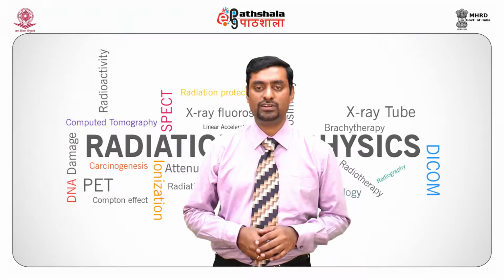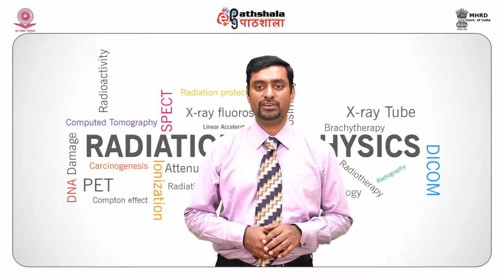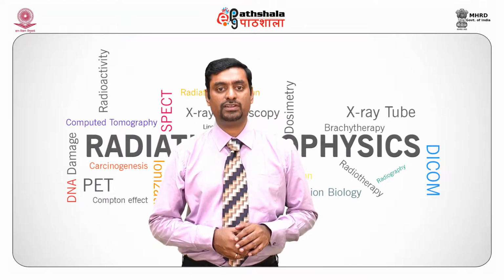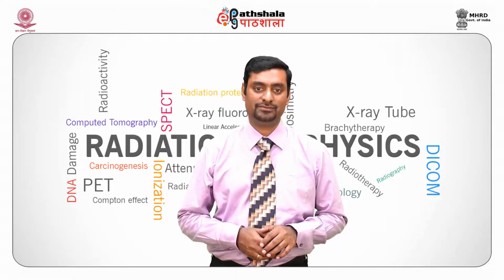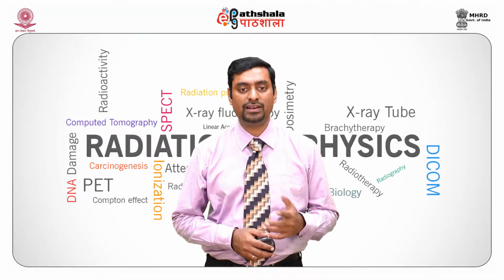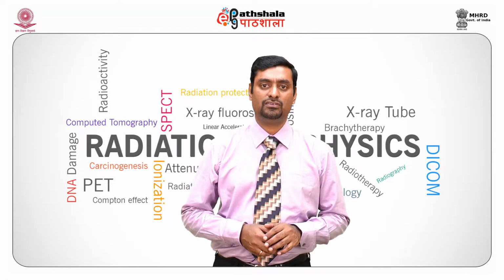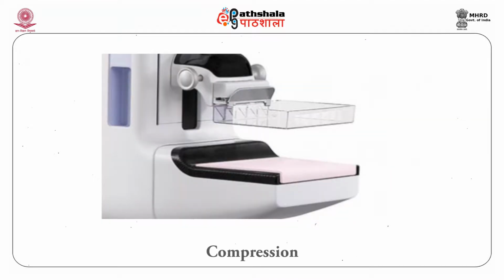There is also a high voltage generator; a near DC high voltage waveform with minimal ripple can be used. The tube voltage should be accurate to about plus or minus 1 kilovolt. The tube current should be about 100 mA or greater on large focus and 50 mA or greater on fine focus. There is also a compression device.